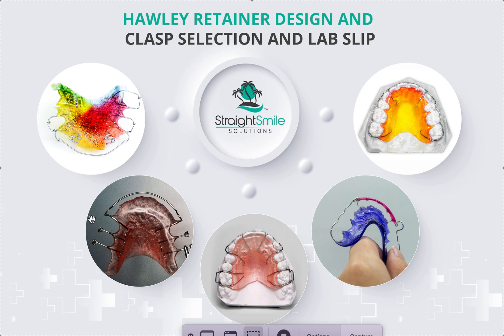Different types of clasps: you've got Adams clasps and ball clasps — they melt the wire so it turns into an actual ball. Then there are labial bows. They can go three-to-three, which is canine to canine, or they can go two-to-two. These are wrap-arounds, which we'll get to in a minute. You can also see guide wires going distal to the ones.